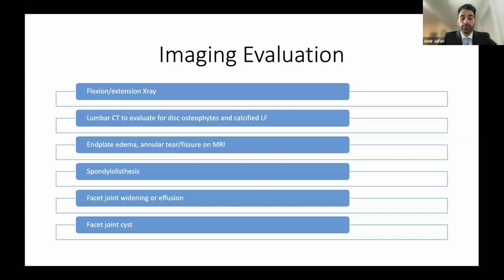An elderly person with severe arthritis has knee pain, the knee swells up, fluid builds in there. Same thing in the facet joint. Fluid builds in there, it can develop a cyst and push on the spinal cord. The cyst over time can adhere to the dura and cause problems, right? You go pull this off, you can cause a dural tear. So you have to evaluate all these things on the imaging to make sure you prepare for whatever is going to show up on the day of surgery.